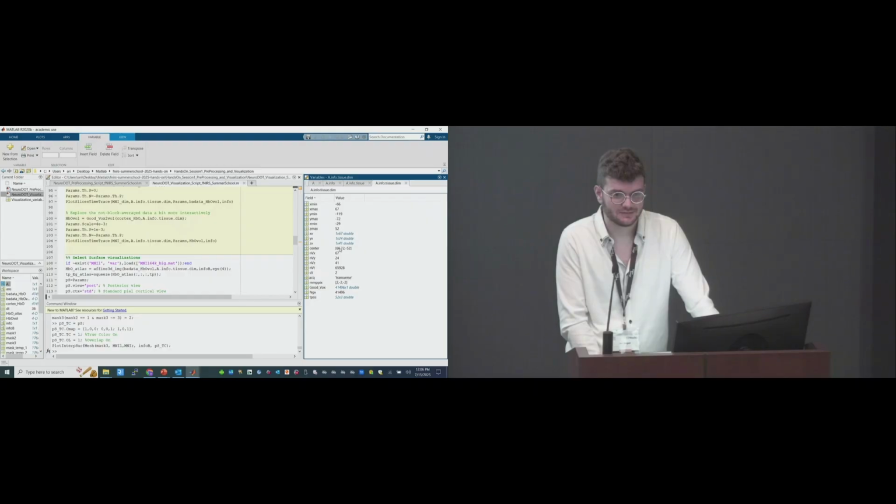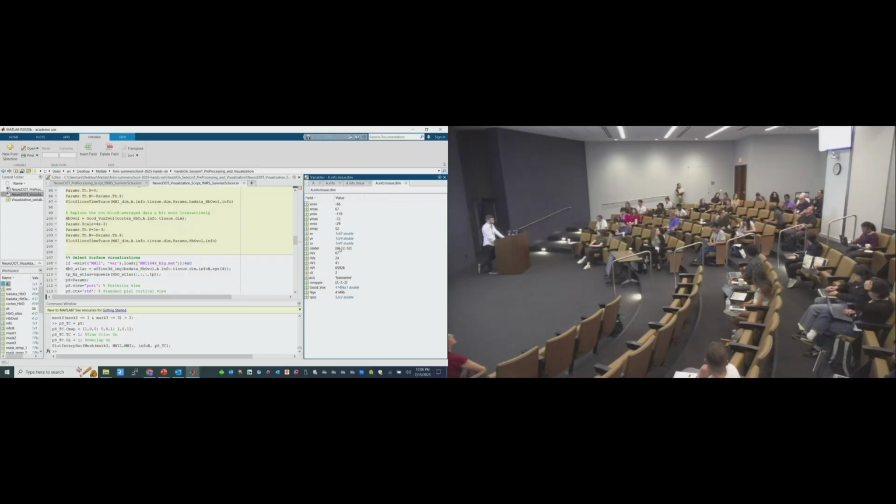I just have one quick clarification. It's normal to talk about going from volumetric data to surface data in terms of a projection, but I think it's helpful to think of it as simply an interpolation, not a projection. The data in the volume are like a brick house, a giant rectangle in space. In that brick house lives the cortex, in exactly the same set of XYZ space.